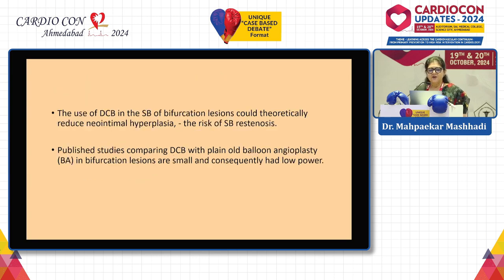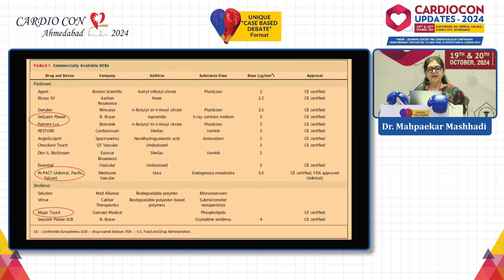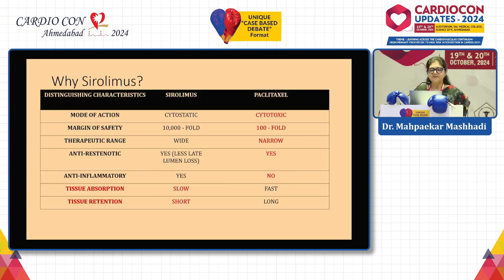This was all a repetition of the previous speakers, but again, these are the available DCBs. There are paclitaxel coated balloons and the sirolimus coated balloon. I've been specifically asked to talk about Nanolute technology. So here I'm going to say why sirolimus and why Nanolute technology.